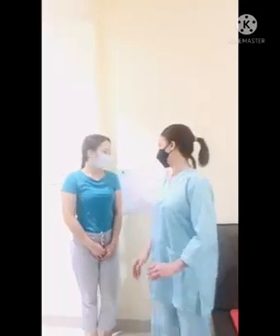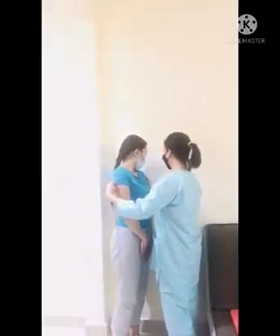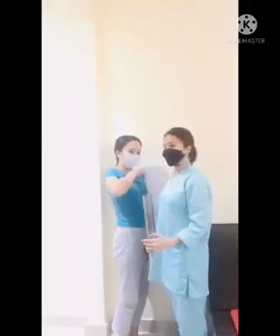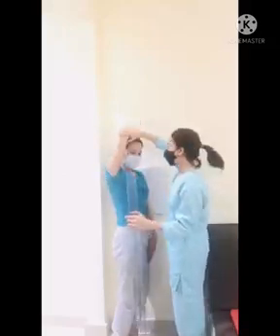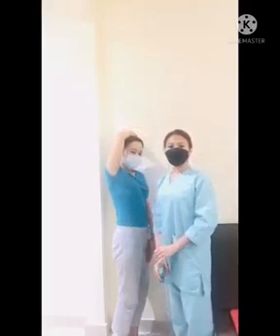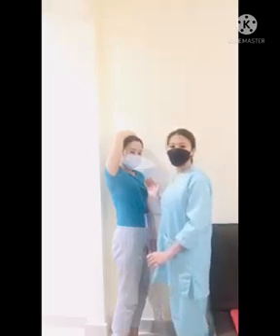So, the second projection that we're going to do is the transthoracic lateral projection, Lawrence method, right or left position. The patient is standing, with the unaffected arm elevated. Side po kay ate. Yung patient po natin is dapat po naka-side po siya, tapos yung hand niya po is naka-taas po siya. The arm is elevated to prevent superimposition of the shoulders.